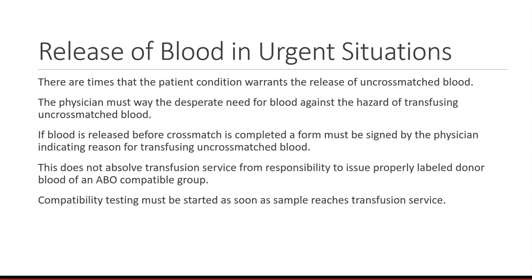Release of blood in urgent situations. There are times that the patient's condition warrants the release of uncross-matched blood. The physician must weigh the desperate need for blood against the hazard of transfusing uncross-matched blood. If blood is released before cross-match is completed, a form must be signed by the physician indicating the reason for transfusing uncross-matched blood. And sometimes this is done after the fact.